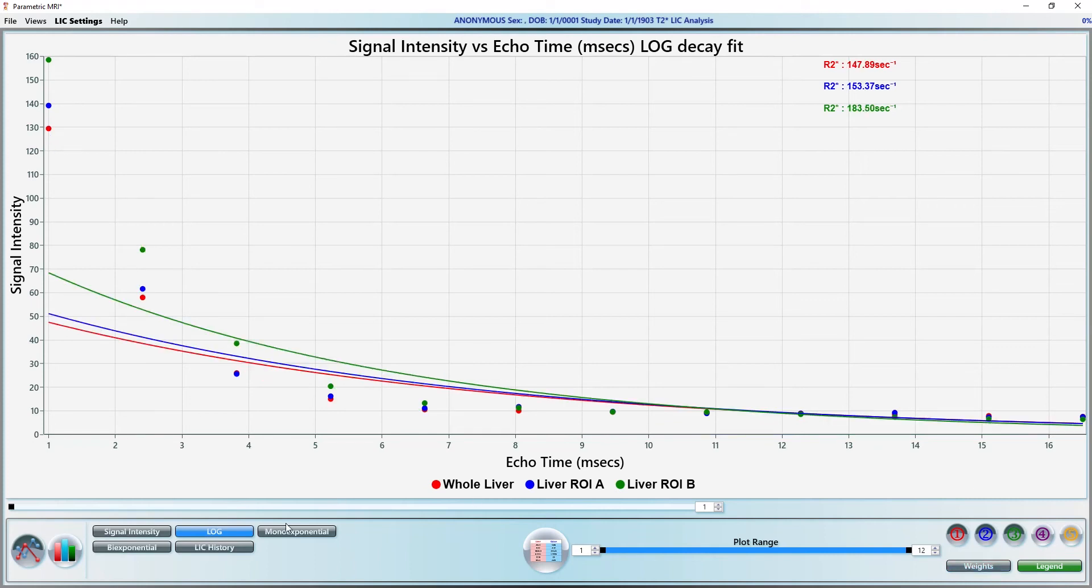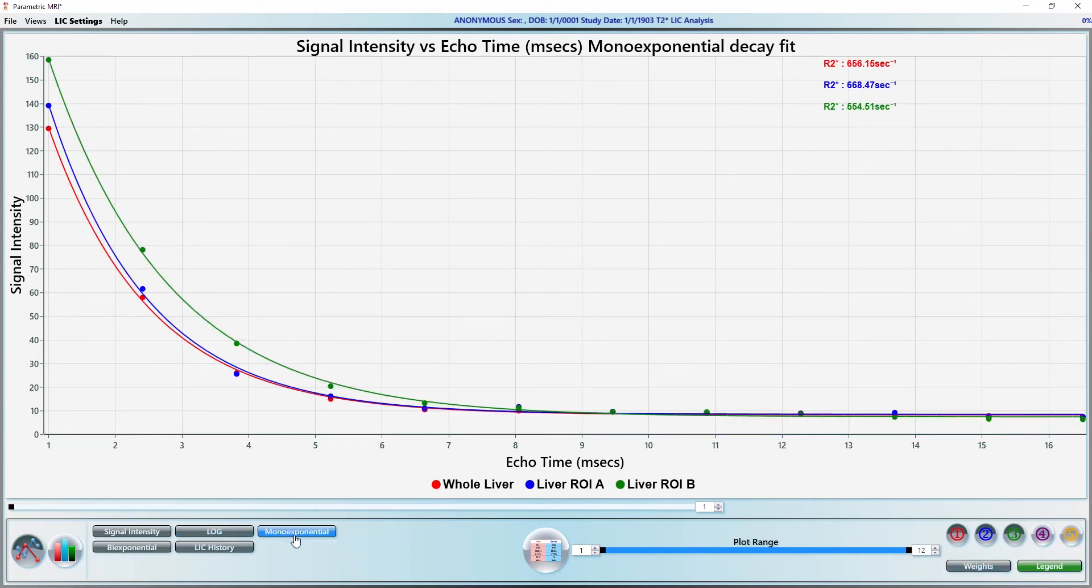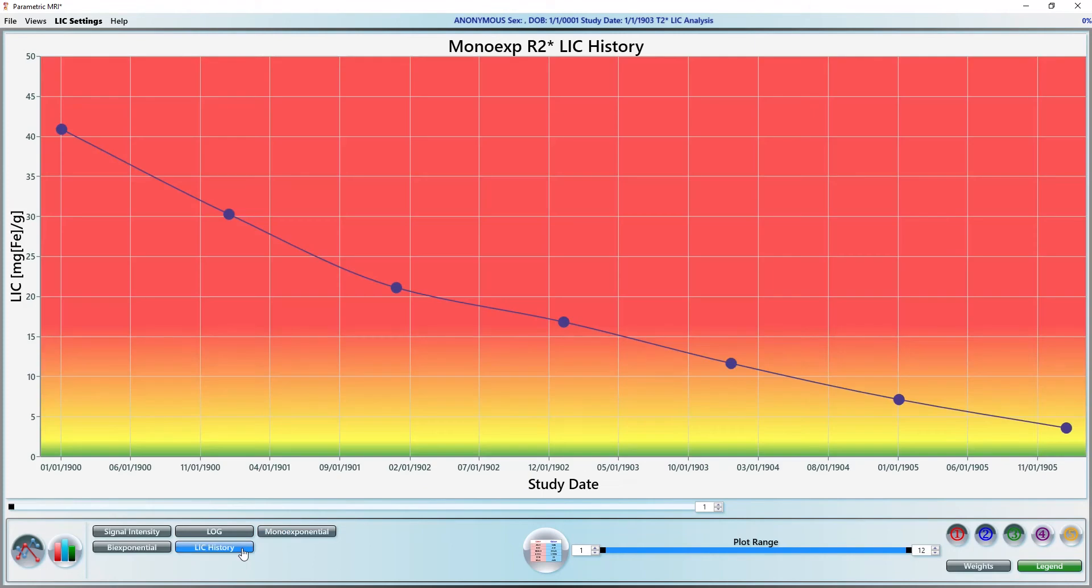Click the LIC history button to display the LIC trend over time for this patient. Any cases that have been analyzed and saved will appear here. The various scan dates have been altered for this video.